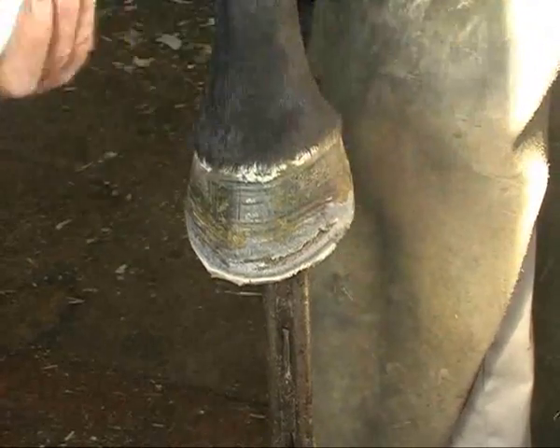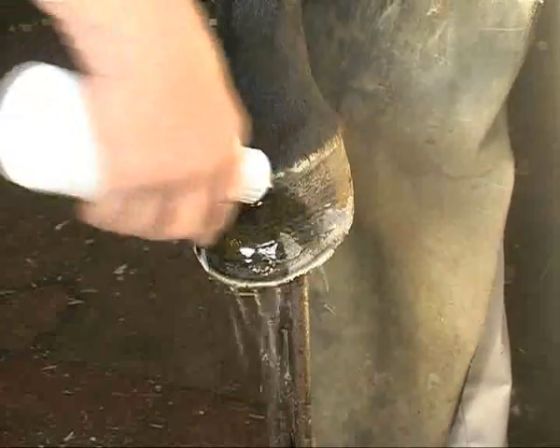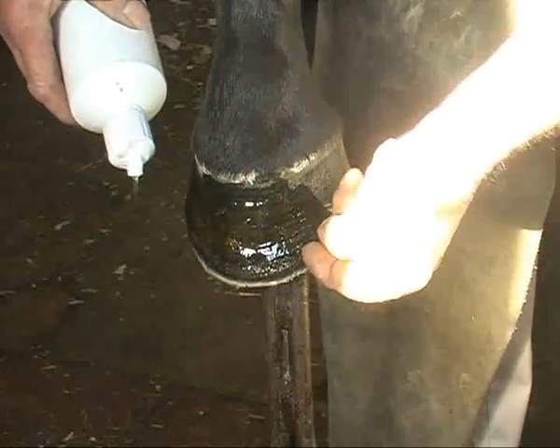We'll try and get as many straight lines as we can — straight line down here, straight line down there. We've got some Equitec degreaser here, denatured alcohol. It kills bacteria. There are a few bacteria in this little bit underneath here, so the cleaner you can get it, the better.